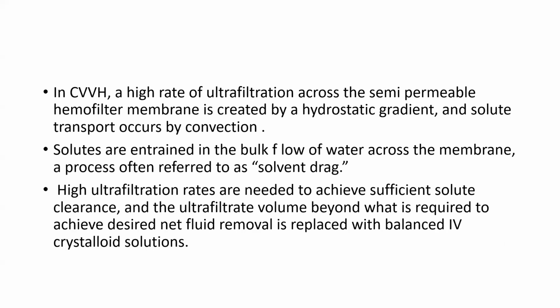So in CVVH, a high rate of ultrafiltration across the semi-permeable hemofilter membrane is created by the hydrostatic gradient and solute transport occurs by convection. Solutes are entirely entrained in the bulk flow of water across the membrane, and the process is often referred to as solvent drag. High ultrafiltration rates are needed to achieve sufficient solute clearance, and the ultrafiltration volume beyond what is required to achieve the desired net fluid removal is replaced with a balanced IV crystalloid solution.